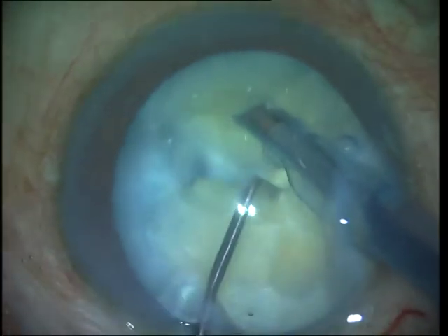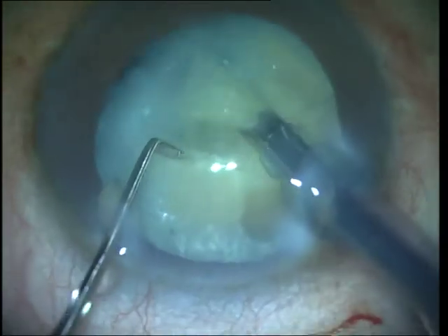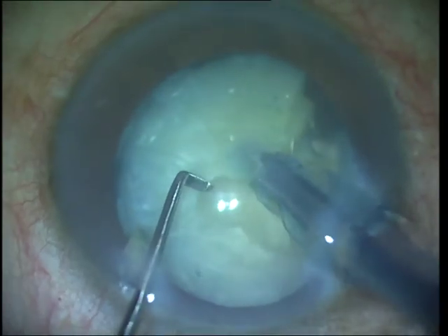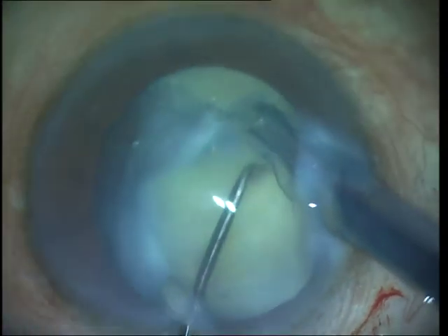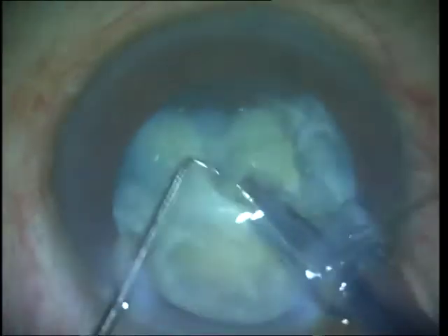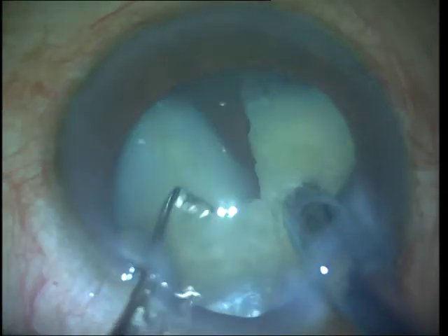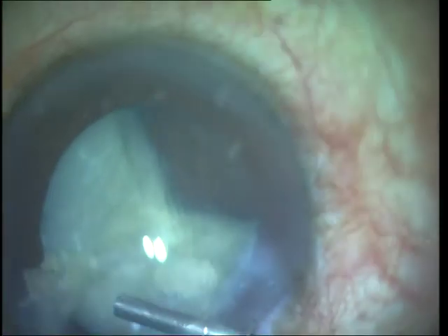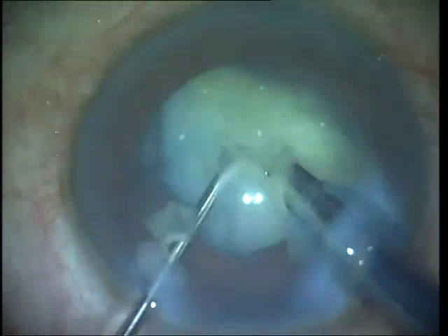I chop the nucleus into smaller fragments, and as mentioned previously, while the bulk of the nucleus is still holding the capsular bag open I can safely emulsify these smaller pieces in the capsular bag. But once I start getting down to the last pieces I need to start working more anteriorly and always be on the lookout for a post-occlusion surge, which could cause the lax and floppy posterior capsule to suddenly move into the phaco tip and cause a posterior capsular rupture.